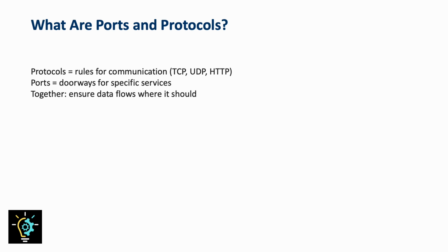Each port number identifies a specific service, for example, port 80 for web traffic or port 443 for secure web traffic. In medical devices, these doorways and rules determine how securely and efficiently a device can share data with others. Knowing them is essential for troubleshooting, designing, and safeguarding connected healthcare systems.